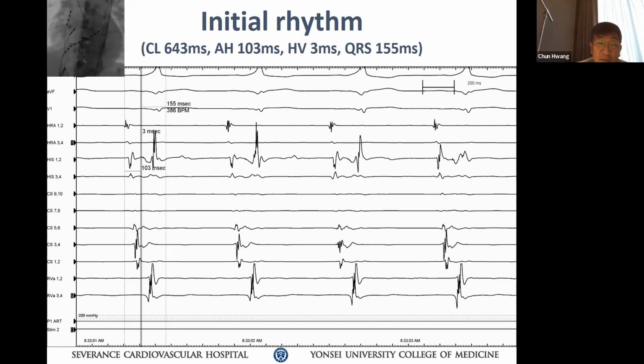So when you have an unstable catheter, you cannot measure things based on that because you are not mapping the same site. So you really need to be careful when you look at the EGM and measure things. Don't just routinely measure, take a look. Now look at the very last beat.